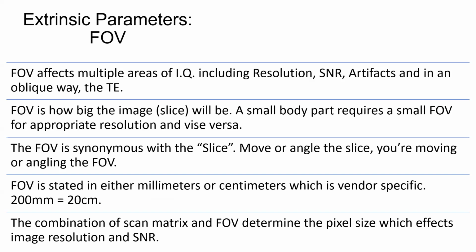Okay, they're all together, they all move together, but think of it that way. So if you look at a loaf of bread, you've got all these slices. Well, each slice is a field of view. Okay, field of view is measured typically in either millimeters or centimeters.